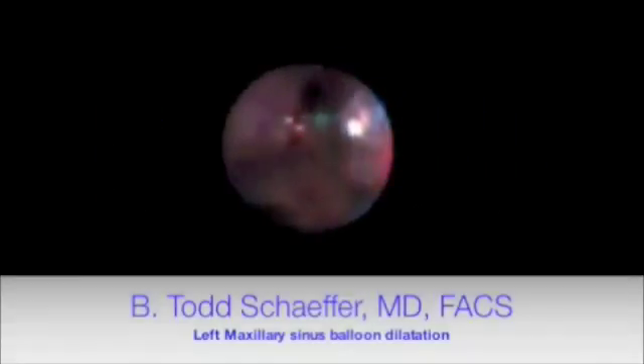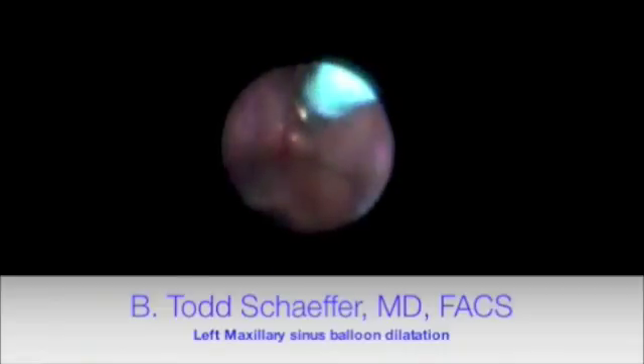The access sheath is left in place. The 0.5mm scope is used here. We see at 12 o'clock the infundibulum ostium. The balloon catheter is placed; several attempts may be made to get the right angulation. It is then passed into the infundibulum, which is narrowed on CAT scan and on examination, and inflated to 12 atmospheres under direct visualization.